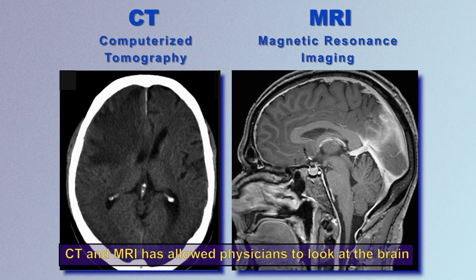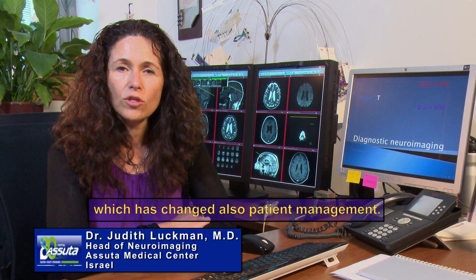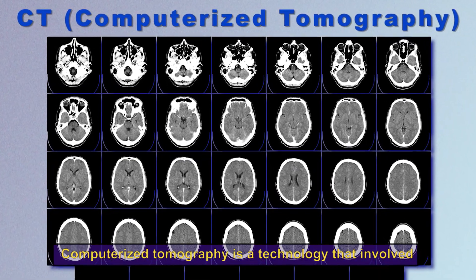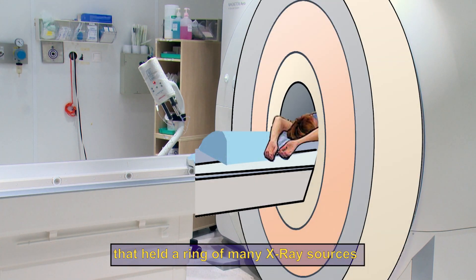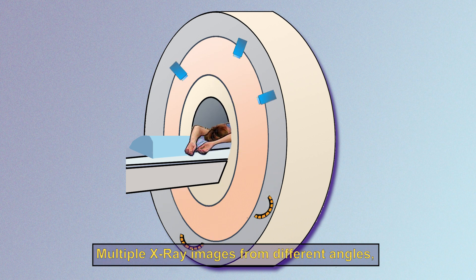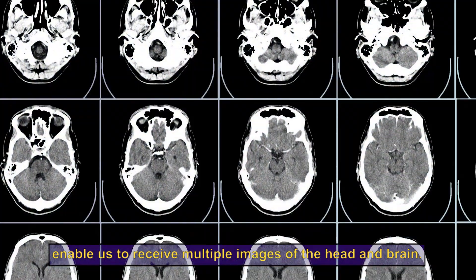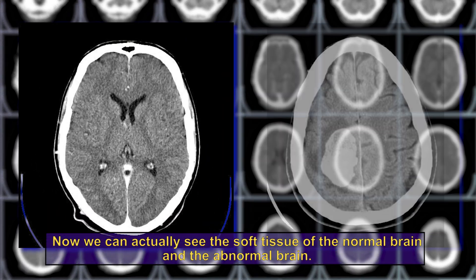CT and MRI have allowed physicians to look at the brain in a non-invasive fashion, which has changed patient management. Computerized tomography involves taking multiple X-ray projections. The patient is put in a tubular structure with a ring of many X-ray sources and opposite many X-ray detectors. Multiple X-ray images from different angles enable us to receive multiple images of the head and brain, allowing us to see the soft tissue of the normal and abnormal brain.